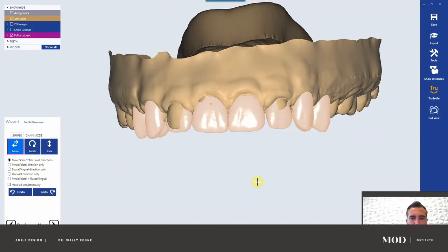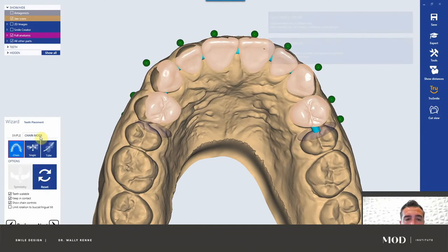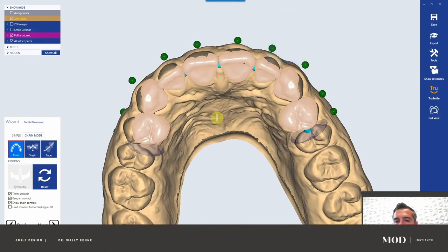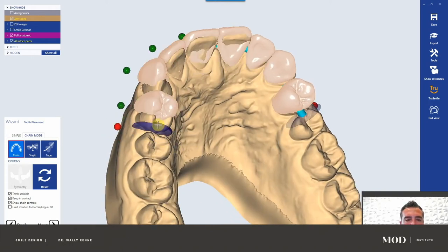Let me turn off my antagonist by hitting A. So why do I like moving things in this view? I really like chain mode — chain mode is just how I like to wax. You're going to lose a lot of what you did in the smile design, but that's okay because it actually keeps those photos and all those measurements that you can go back to.